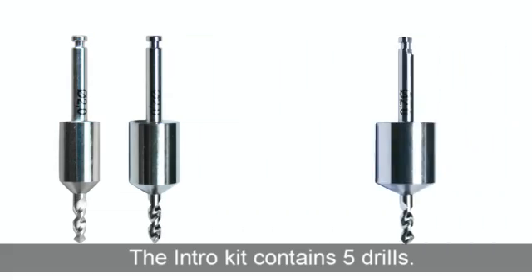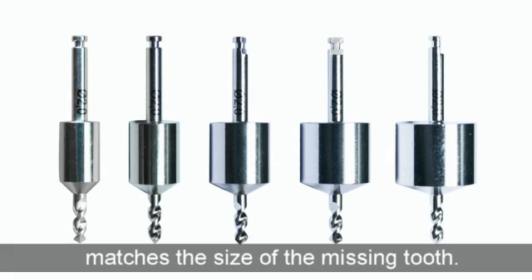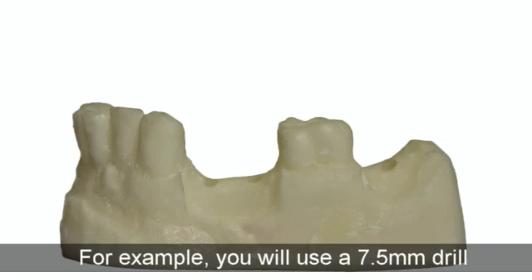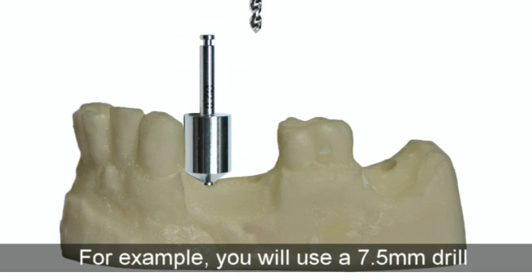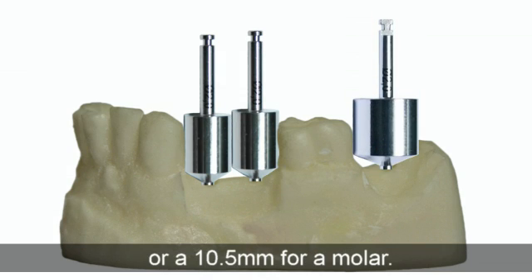The intro kit contains five drills. The diameter of each drill matches the size of the missing tooth. For example, you will use a 7.5 mm drill for a lower premolar or a 10.5 mm drill for a molar.